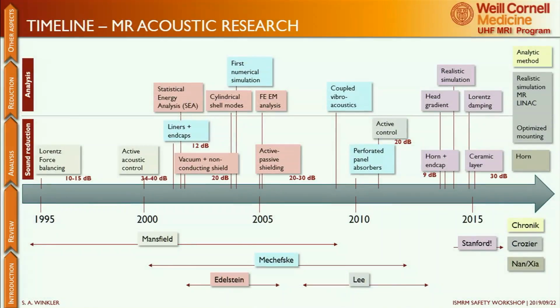Now, in terms of what has been done in acoustics, actually, it was kind of shocking when I started to work on this, not very much. These are pretty much all the papers I found. So early on, people tried some trial and error methods to reduce sound pressure levels. Later on, some analysis started, but computational power was still limited, so these were fairly basic. This one's analytical shell modes.